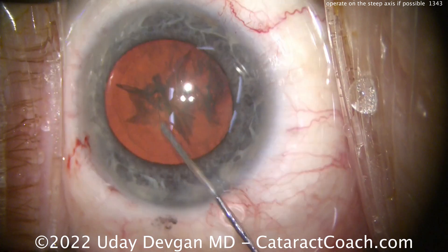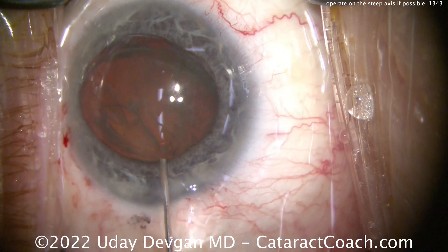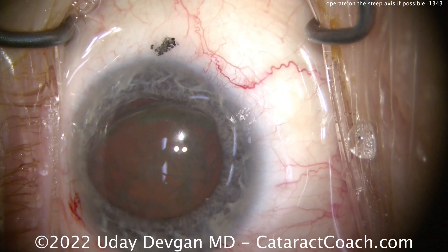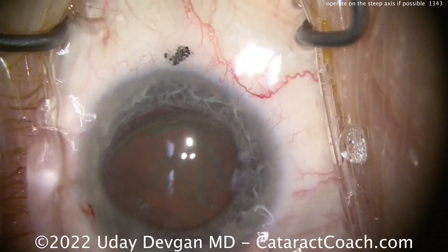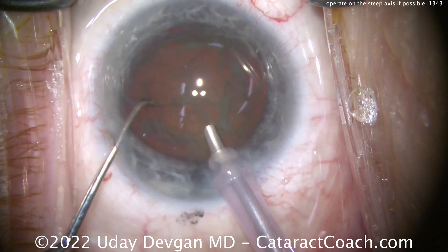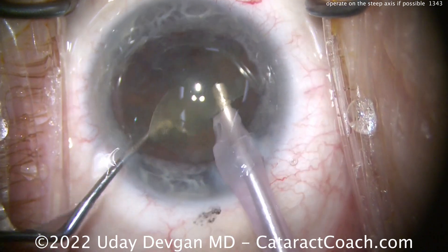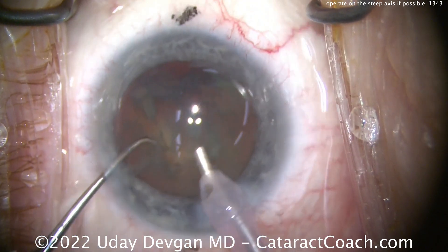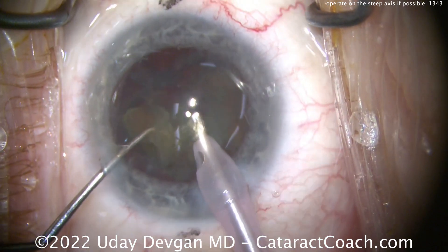If you've done at least 100 cataracts, it's okay to start making the incision where it benefits the patient the most. In this case it's going to be at 30 degrees. In other videos you'll see me shift my incision even more — I'll sit superior if the incision needs to be at 90 degrees, move my hand to the side for 60 degrees, or even switch hands and go left-handed if I need to make the incision at, say, 145 degrees. You don't have to switch hands especially early in your career, but try your best to operate on the steep axis.